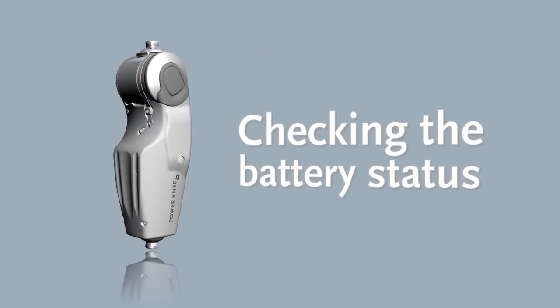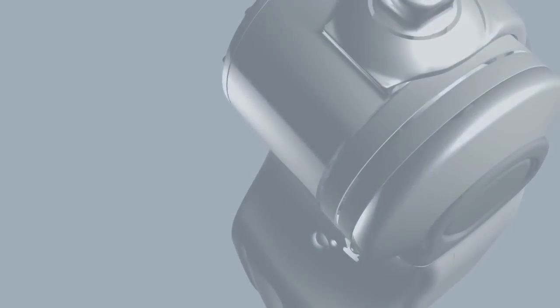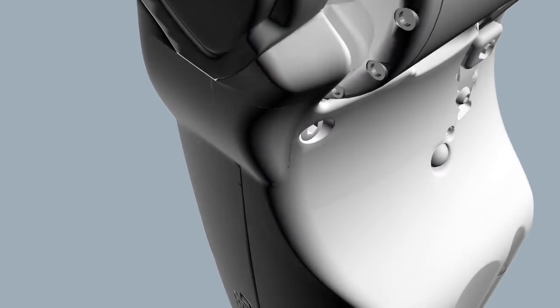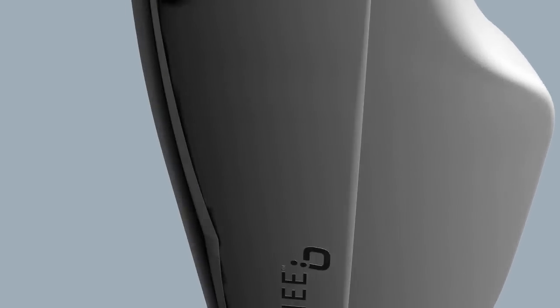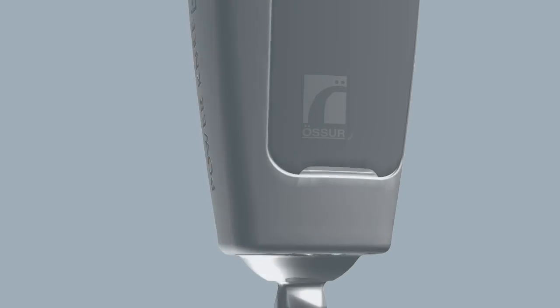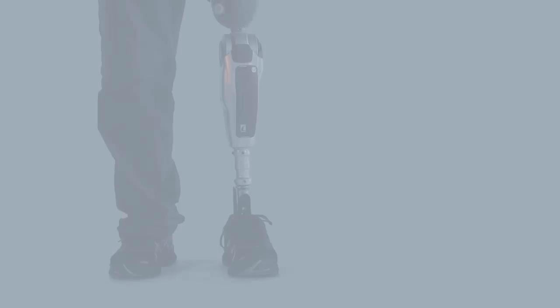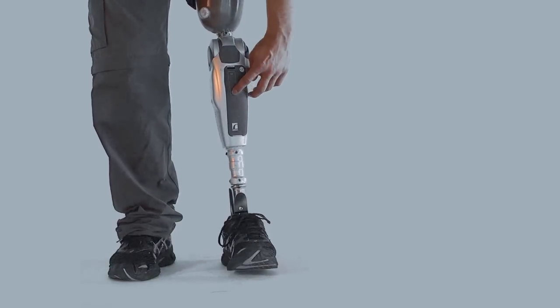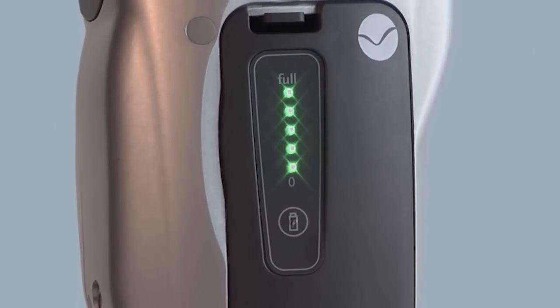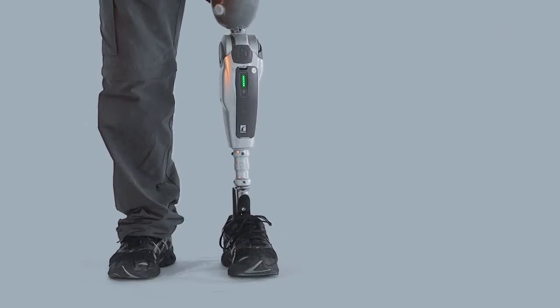Checking the battery status. You can check the battery status at any time. It doesn't matter whether the battery is in or out of the prosthesis or the charger, or whether either of them are connected. To check the battery status, press the battery status button. If all five lights go on, the battery is fully charged.